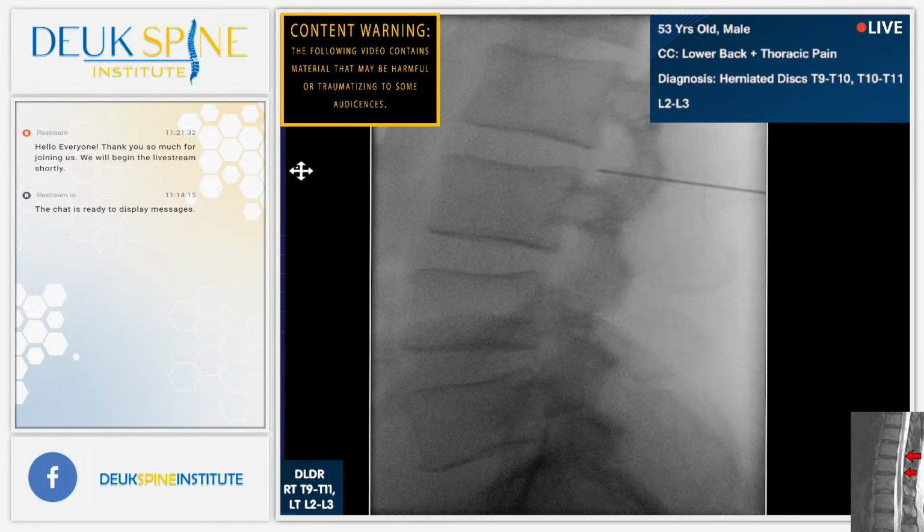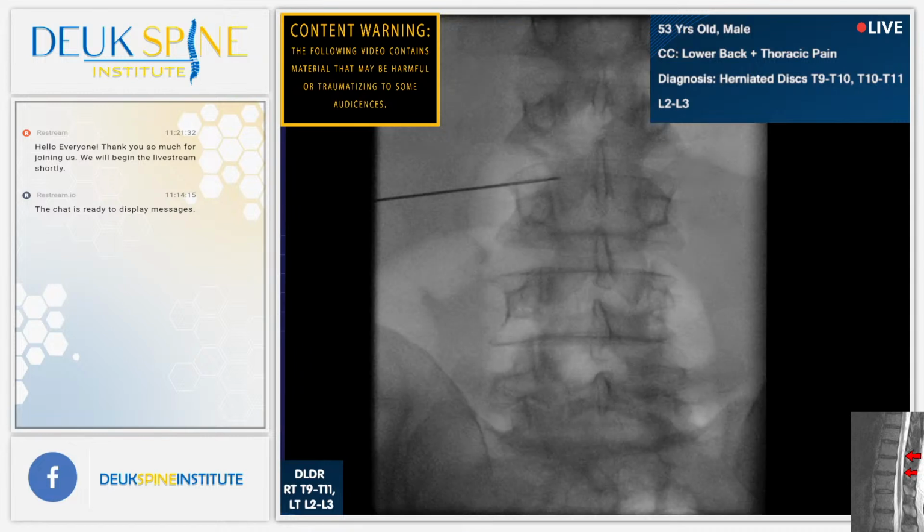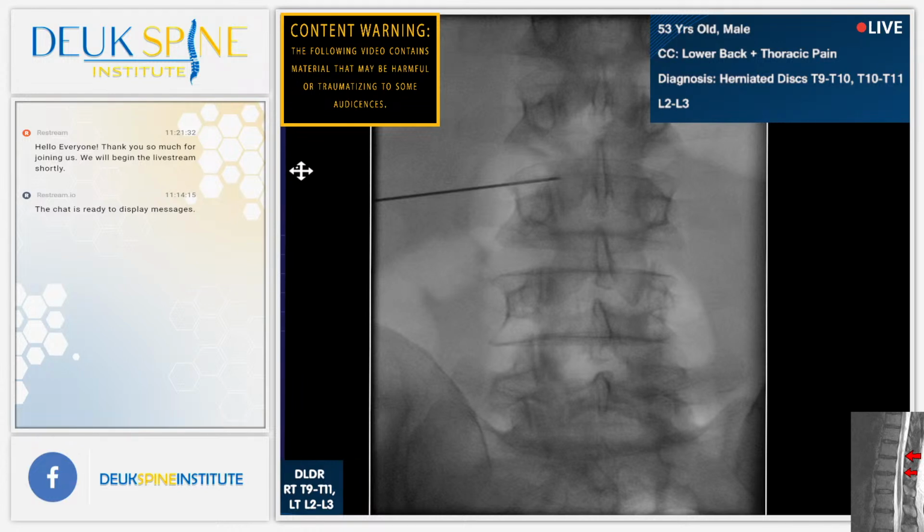Oh, it's fascinating. I could actually feel a herniation right there. Don't really see it on the MRI, but that's where his pain was localized to. Okay. Let's get an AP. We're going to use navigation equipment called a fluoroscope, which is actually an X-ray machine that can swivel and take pictures in different planes. Yeah, looks pretty good.